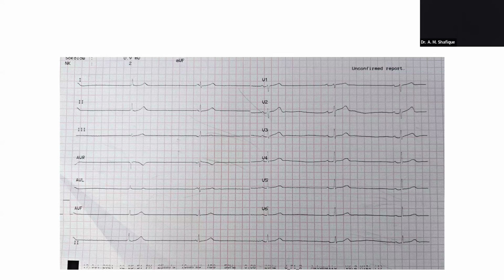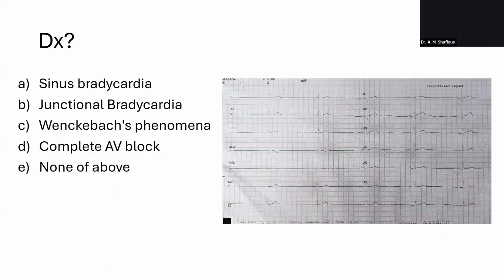So I got the ECG, and you have seen the ECG. And for the fellows, what could be the diagnosis? Is it a sinus bradycardia or junctional bradycardia, Wenckebach's phenomena, complete atrioventricular block, or none of the above?